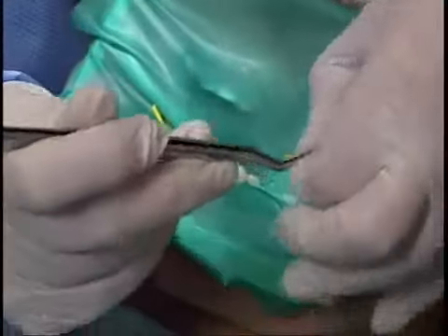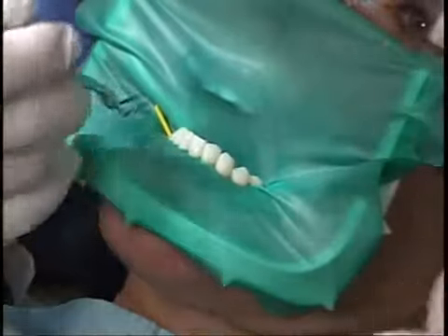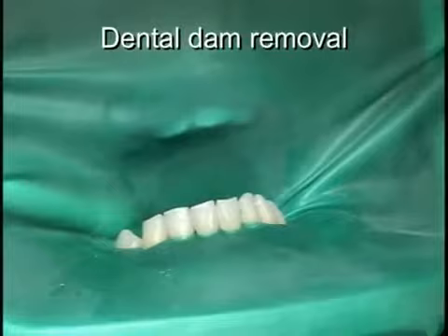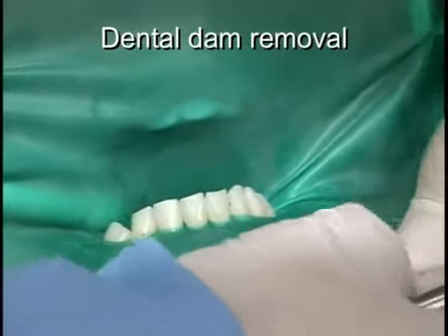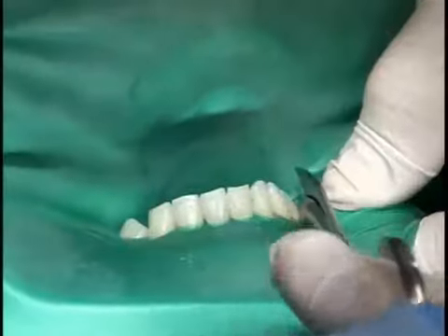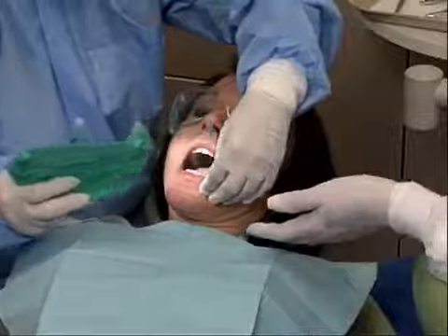Dental dam removal is most efficient if this sequence is utilized. First, remove both Wedgetts Cords. Secondly, place a finger in the buccal vestibule to protect the patient's soft tissues and cut the interceptal dam with blunt-ended scissors. After all the interceptal dam is cut, remove the dam and the frame as one unit.